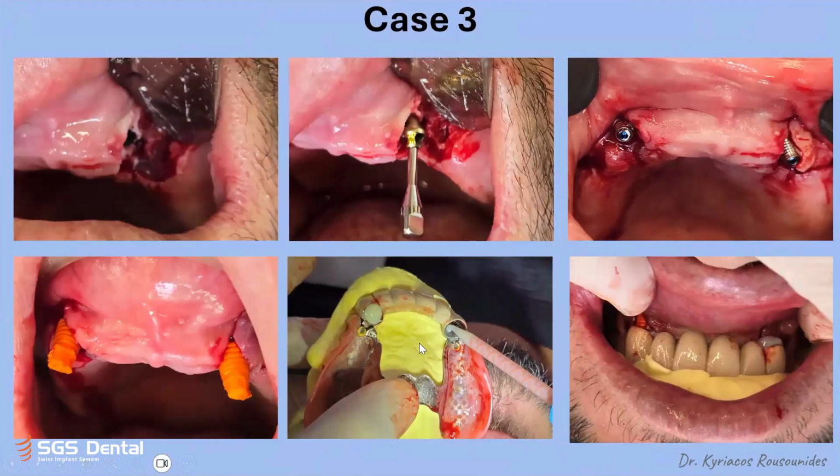We had to face the same problem. The only way it was possible to place the implant was in the frontal area, not on the back area, because there was not enough bone on the buccal area. Here you can see how we took impression again. We had to modify the impression caps of our multi-units a bit, and we inserted composite on his prosthetics, and we let him bite on that.